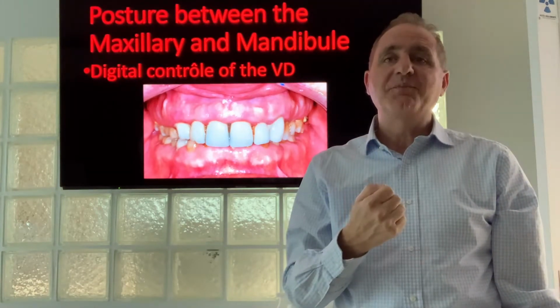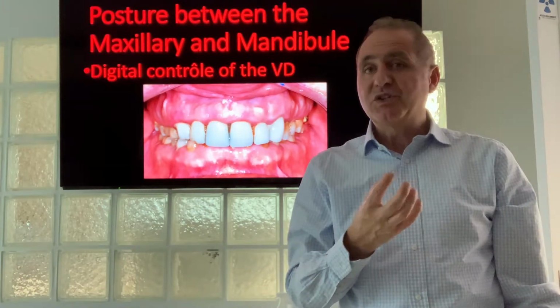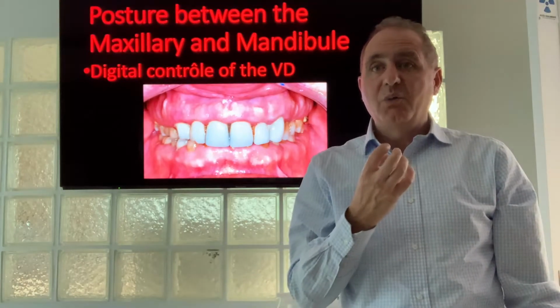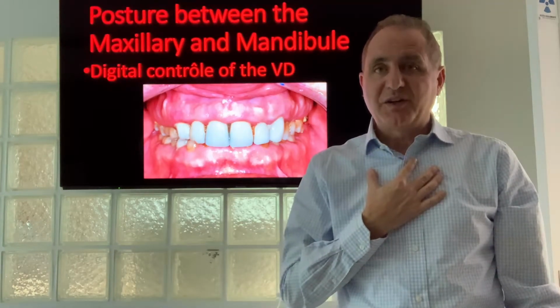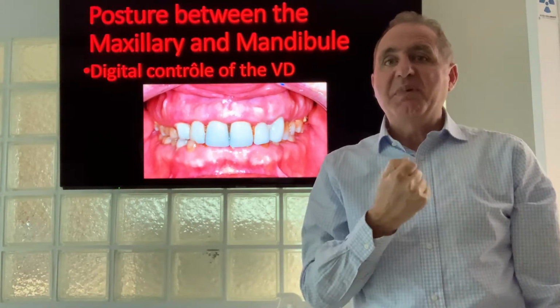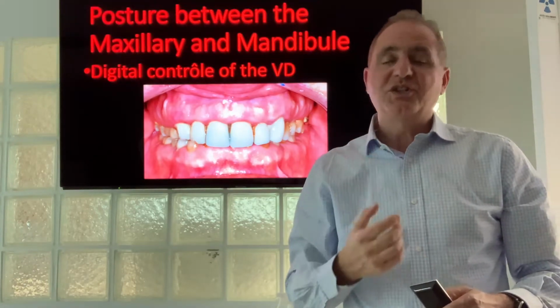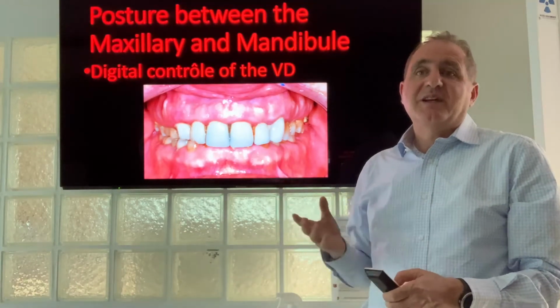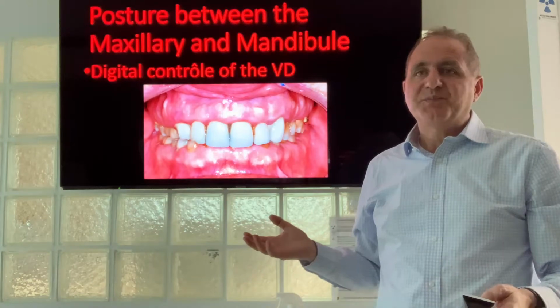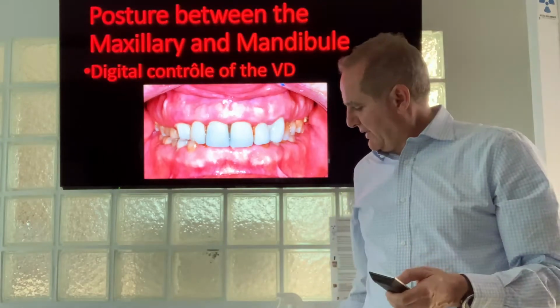So I will show you today how, for your oral rehabilitation, if you want to increase or decrease the vertical dimension or the posture of the lower jaw, we can achieve this posture according to our fundamental knowledge, and at the same time be helped by the digital workflow, to compare and see the situation digitally. This is first just an introduction image, to show you that this patient has surely lost her vertical dimension and we need to increase it. So how can we proceed?